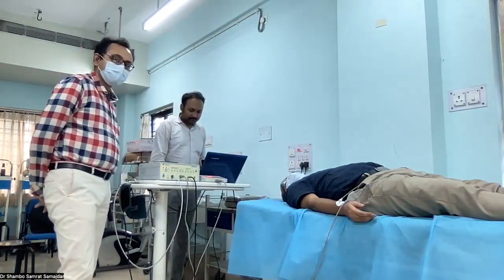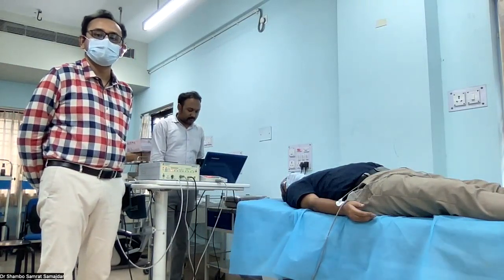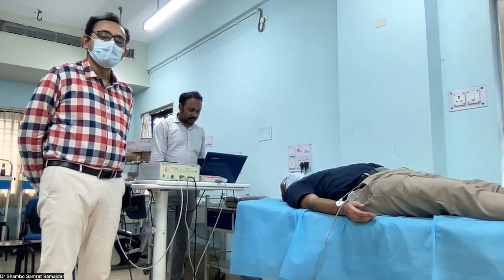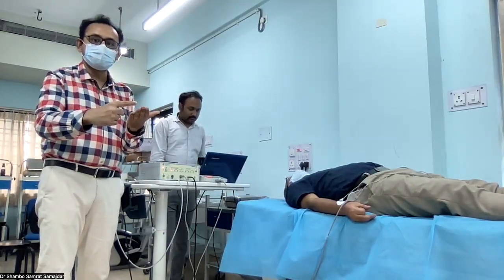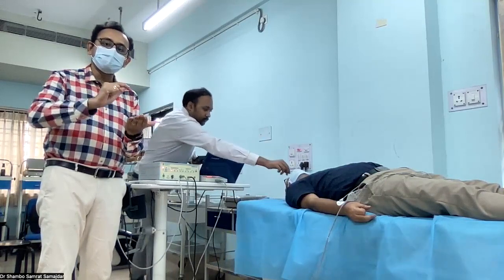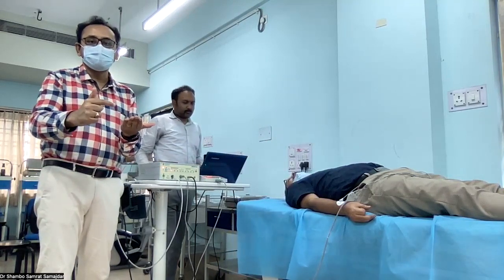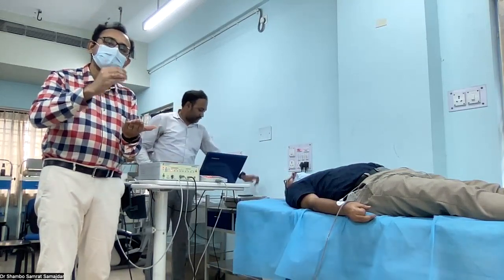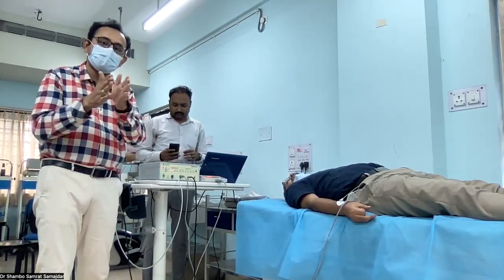We will take the ECG. As we had mentioned previously, what is the method of inspiratory expiratory ratio testing while doing ECG? That means we need to ask patients for inhalation for 5 seconds, then 5 second exhalation, and we need to record that RR interval. So we all know that with inspiration heart rate rises, with exhalation the heart rate decreases. So with inhalation, what happened? The heart rate increases, which means RR interval will be reduced, and with expiration the heart rate will be decreased, but RR interval will be more.